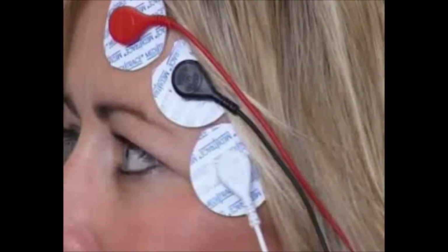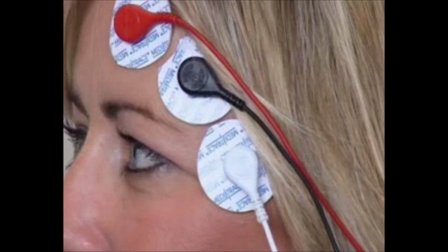No. Okay, good. So we've got the biofeedback EMG, we've got some sensors over one of the main clenching muscles. This muscle is called the temporalis muscle, and we're going to look at the readout on a computer screen of the degree, the intensity of clenching without the splint, and then with a full mouth splint, and then with the MCI splint. Okay, let's start with the demonstration, and let's measure the degree of clenching that you can do with this temporalis muscle.